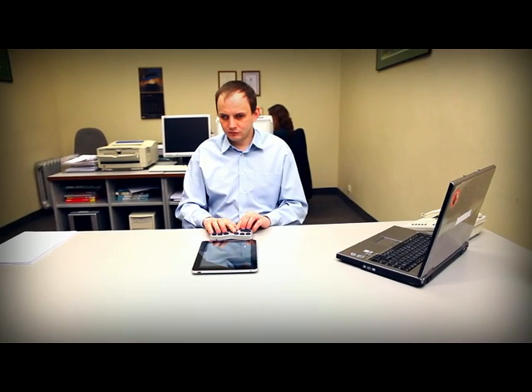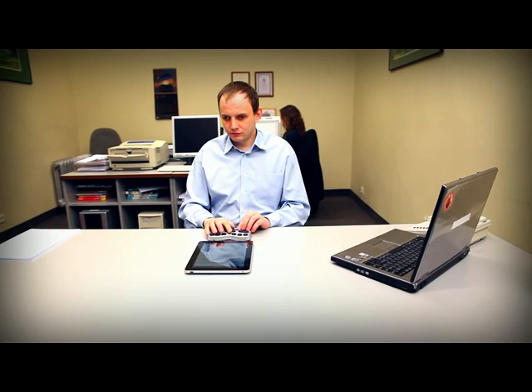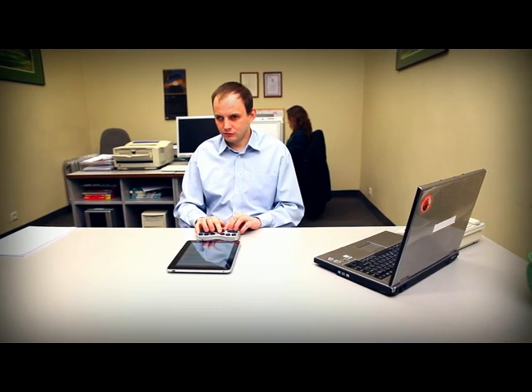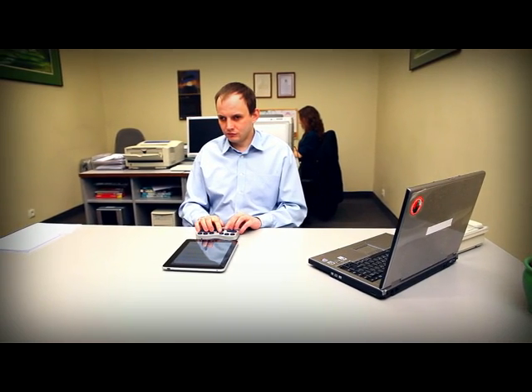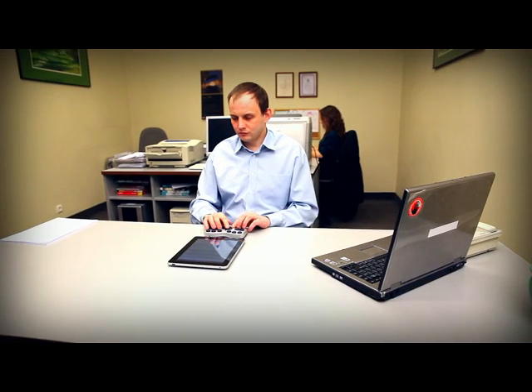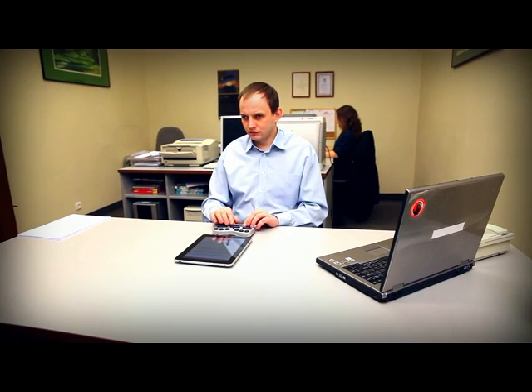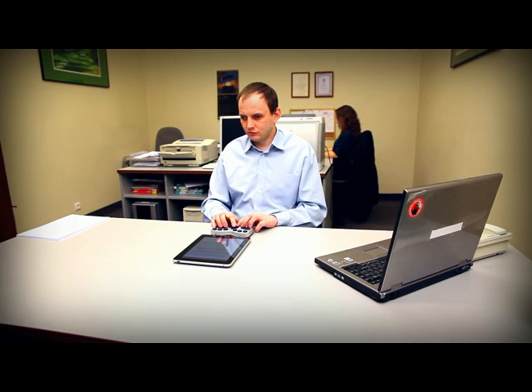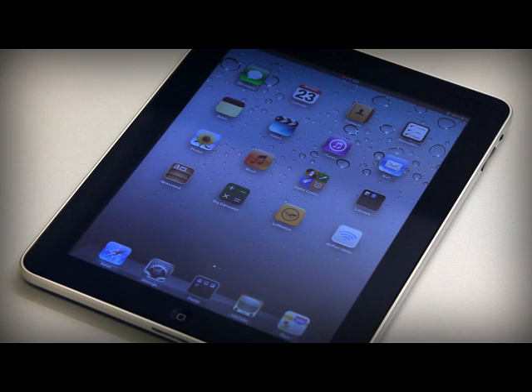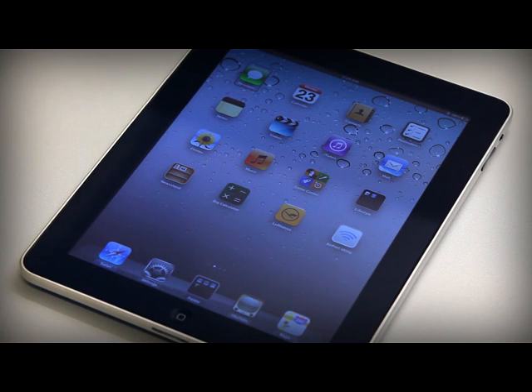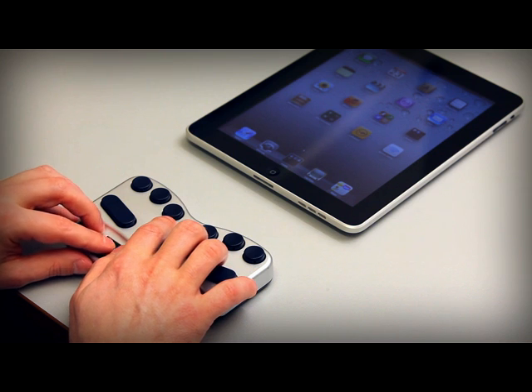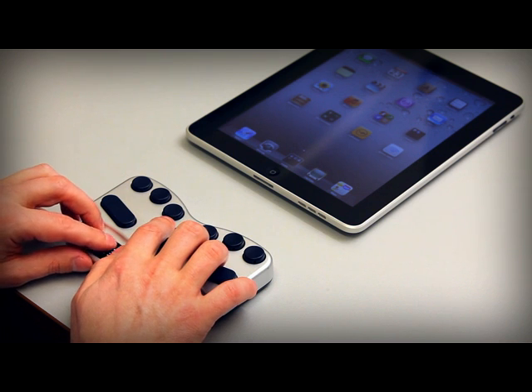If you press space plus dots 2456, you can stop the reading at any time by pressing joystick up or joystick down. If you press joystick left, the cursor will move back one icon. If you press joystick right, the cursor will move forward one icon. When you land on Notes, VoiceOver will say 'Notes. Double tap to open.'